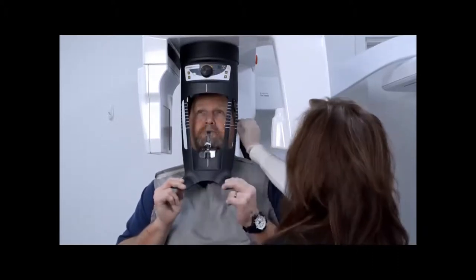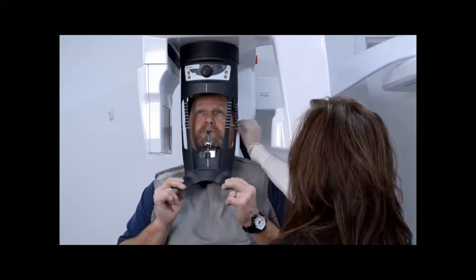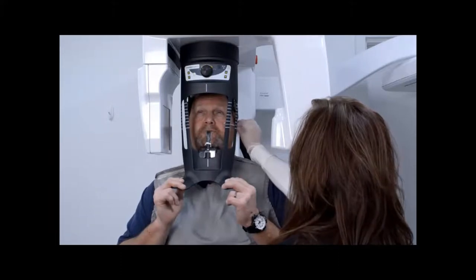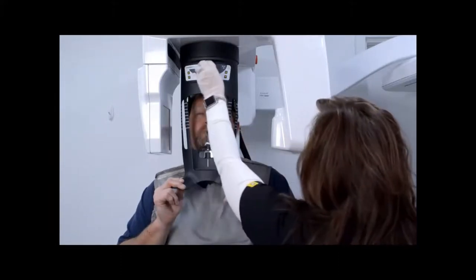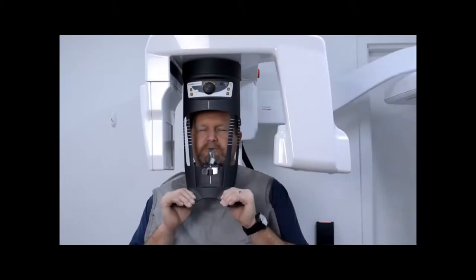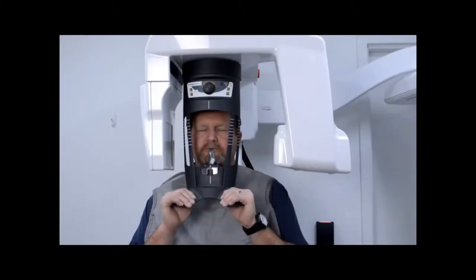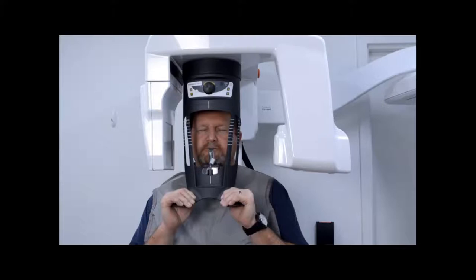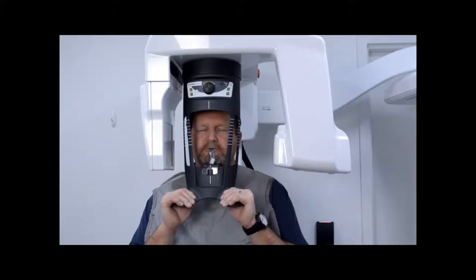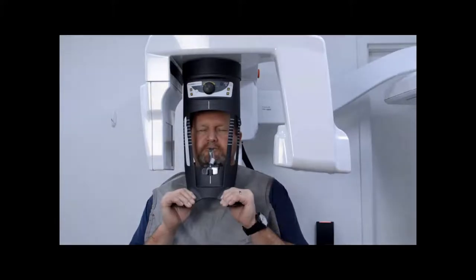The camper plane passes through the lower border of the nose and the tragus of the ear. Using both hands, align the horizontal and vertical position of the head. Ensure that the patient's midline is aligned with the spine. Ask the patient to close their eyes, remain still, and breathe through the nose. Instruct the patient not to swallow during the acquisition. Place the tongue on the palate.